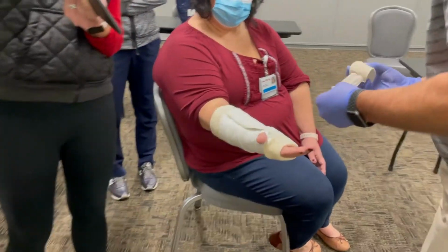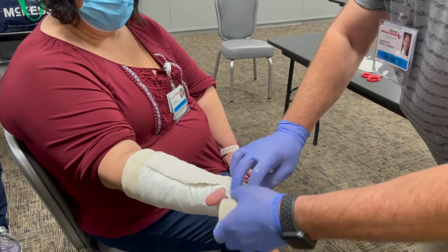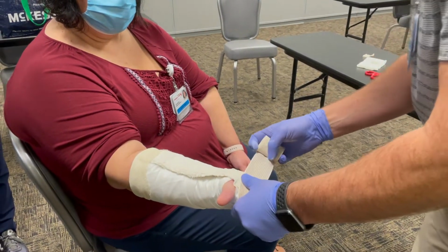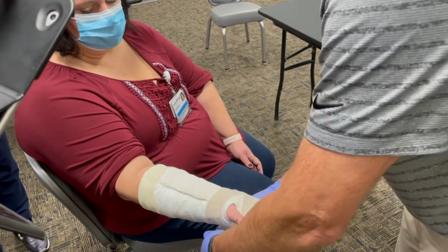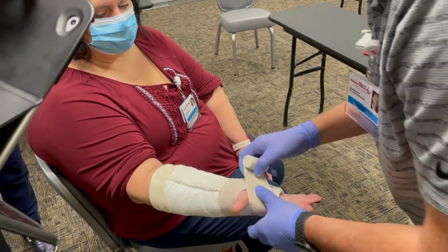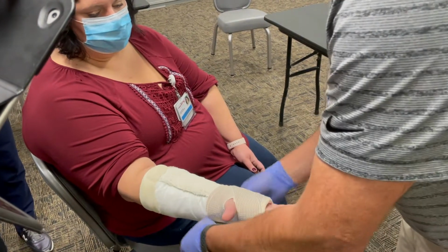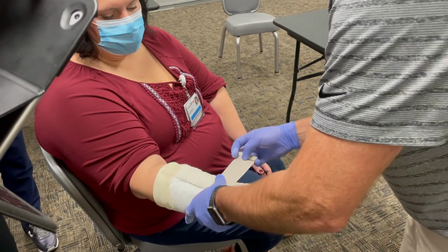It really does. I mean, plaster, I rip on it all the time, but it was a good invention. I didn't realize, I thought the fiberglass was a lot more expensive. But so we're just wrapping. I like 2-inch. I think it just goes around the wrist and hand. You can use 3 and cut a hole for the thumb. I've done that many times.